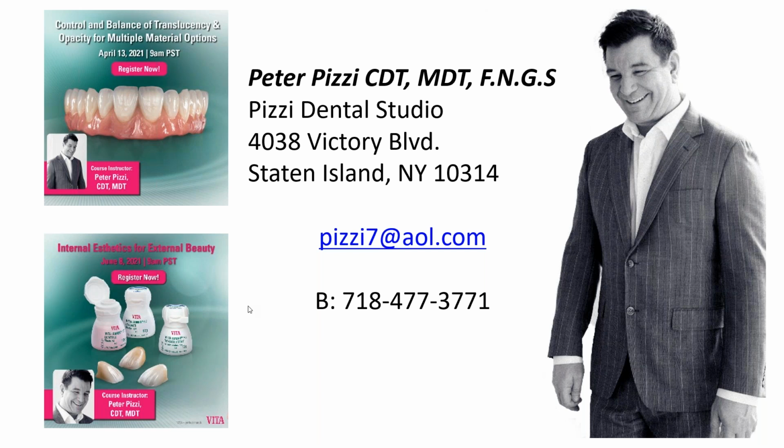This way, it's a very simple change to make it easier for clinicians who have their assistant take the photographs. I don't want them playing with buttons, but I never shoot below that. If I needed more light, I'm not going to drop to f22. I'm just going to give myself more light with my flashes.